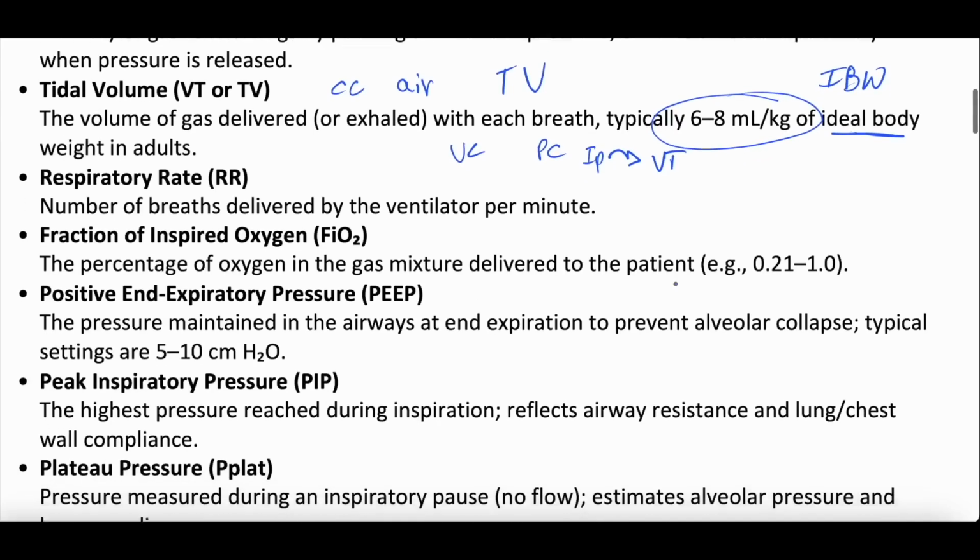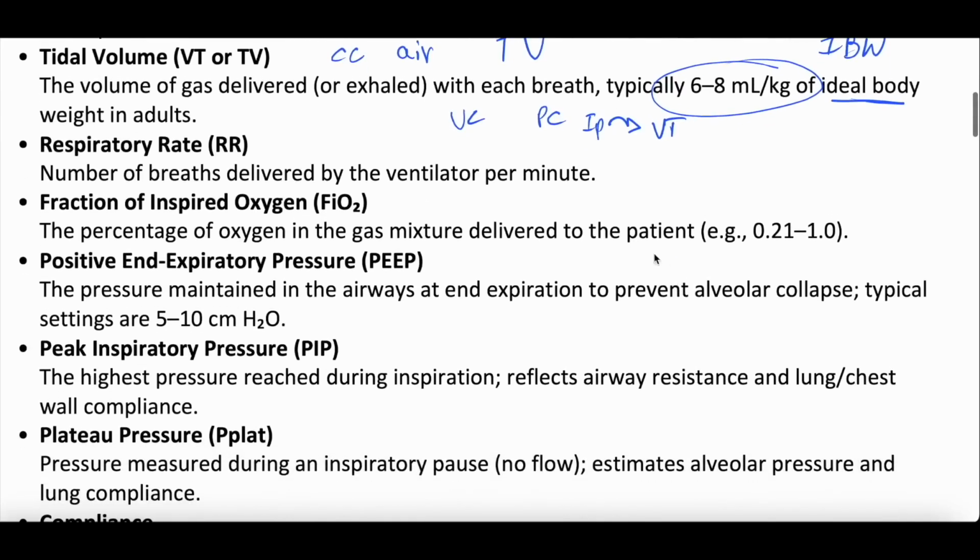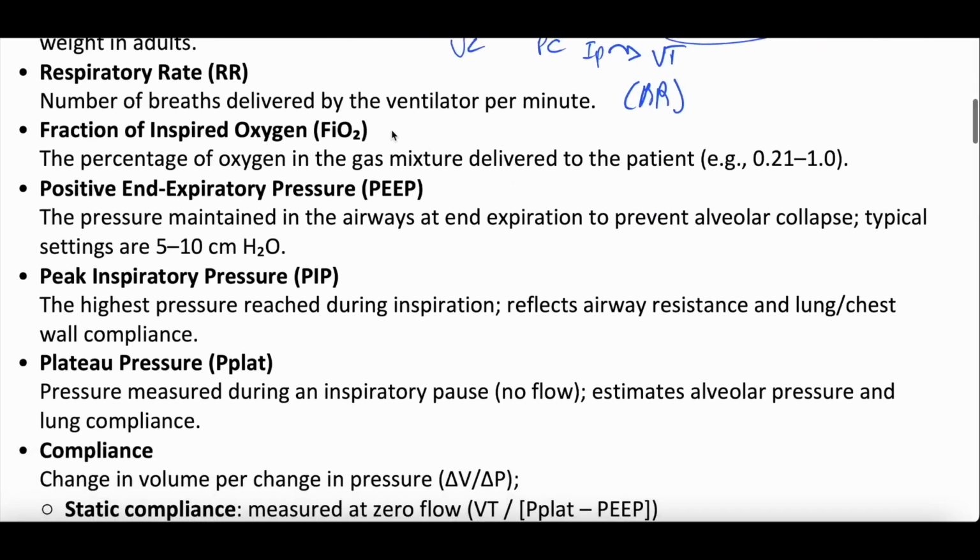The respiratory rate, this is the number of breaths delivered by the ventilator per minute. We set this. This is the respiratory rate. It's breaths per minute.